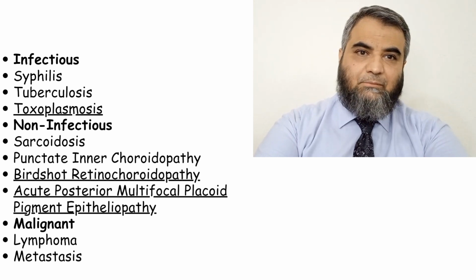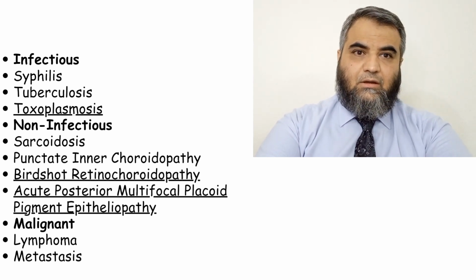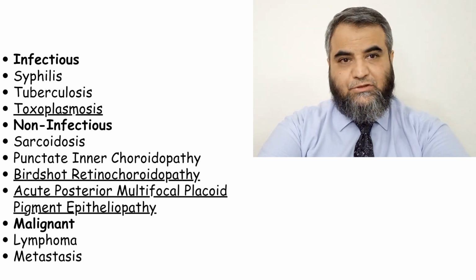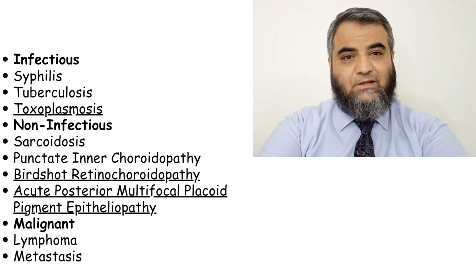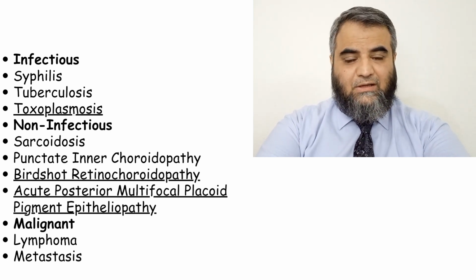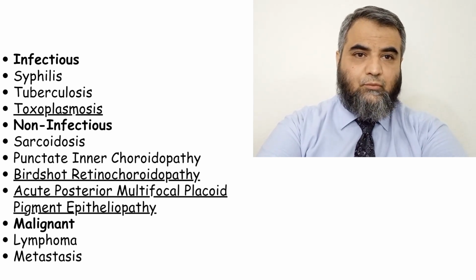Differential diagnosis includes many things. Apart from taking a proper history, we have to go for blood work and investigations. Earlier we discussed the images: fundus fluorescein angiography, autofluorescence, and the role of OCT. Even OCTA is very helpful, as I mentioned in my previous presentations; the choroidal neovascularization blood vessels can be localized. Imaging is very helpful, but we also have to go for blood work.